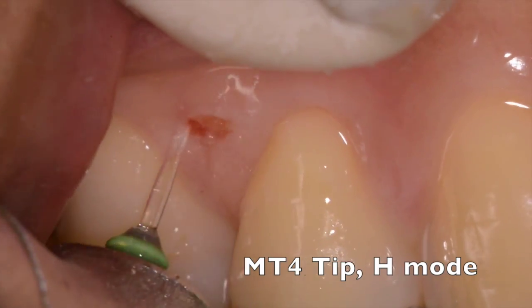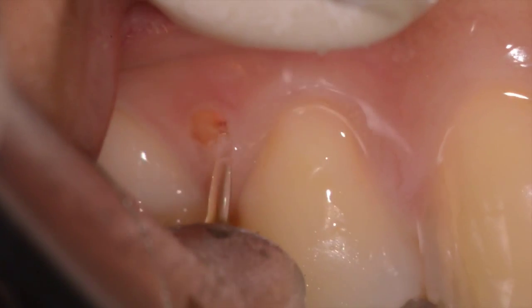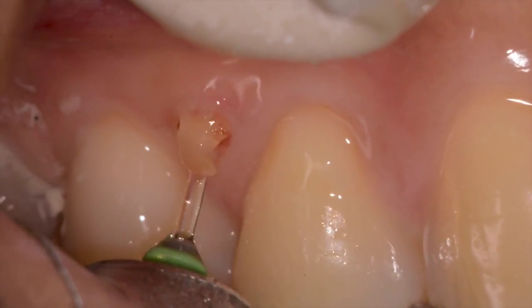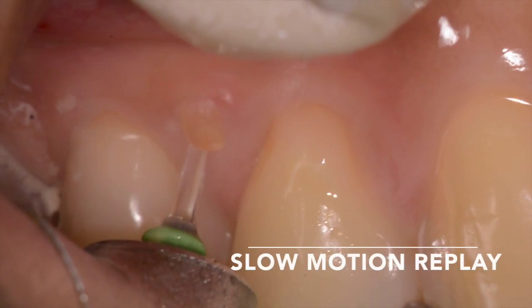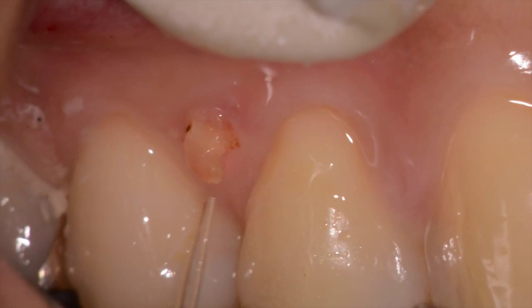You can see an MT4 tip being used in H mode, and as we gradually go deeper and deeper around the root, we can see that it starts to move. We use the tip gently pressing against the root to make it move. You can see here in a slow motion replay how the laser actually removes a retained root from the attached tissue.